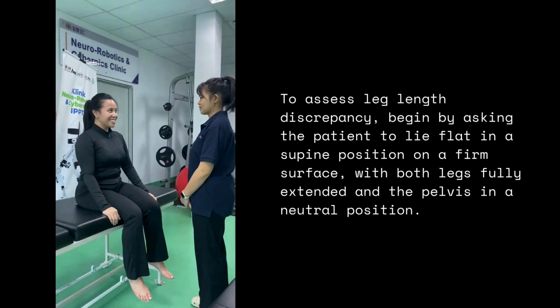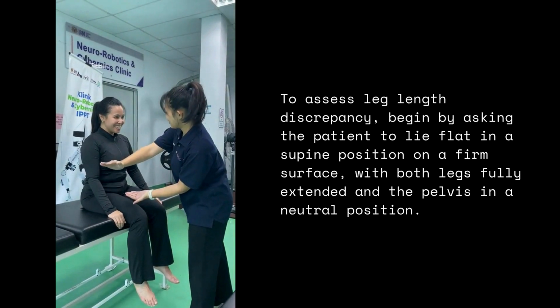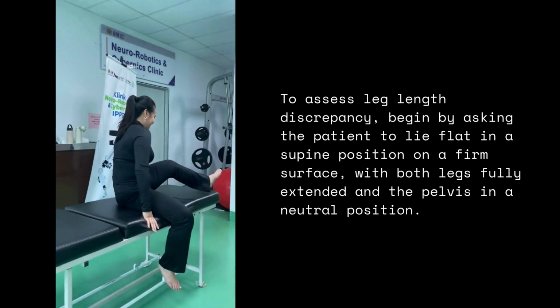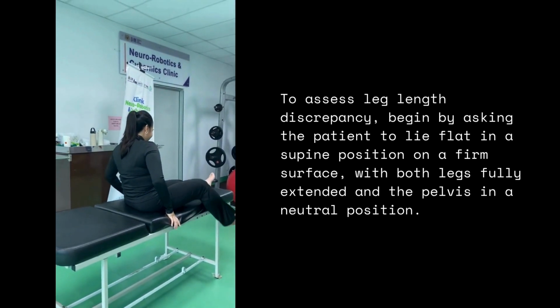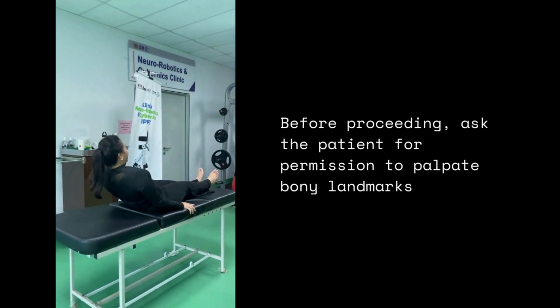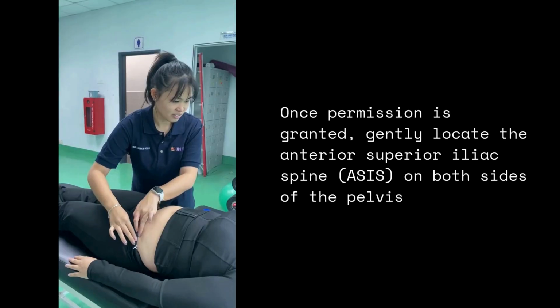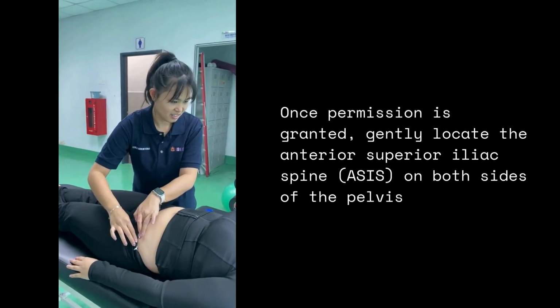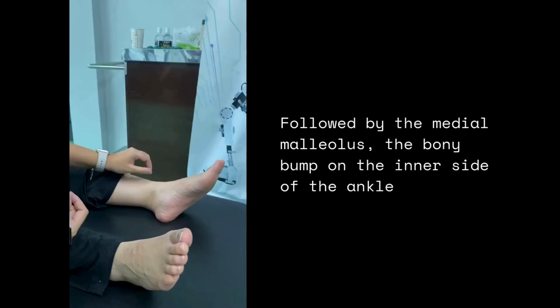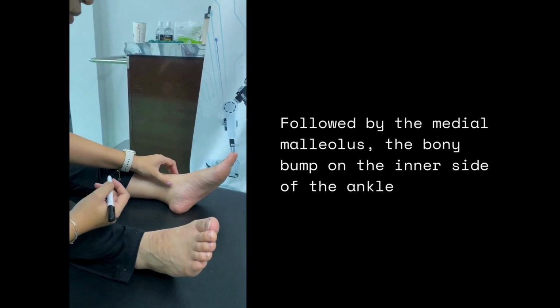To assess leg length discrepancy, begin by asking the patient to lie flat in a supine position on a firm surface, with both legs fully extended and the pelvis in a neutral position. Before proceeding, ask the patient for permission to palpate bony landmarks, as this involves physical contact. Once permission is granted, gently locate the anterior superior iliac spine, also known as ASIS, on both sides of the pelvis, followed by the medial malleolus, which is a bony bump on the inner side of the ankle.